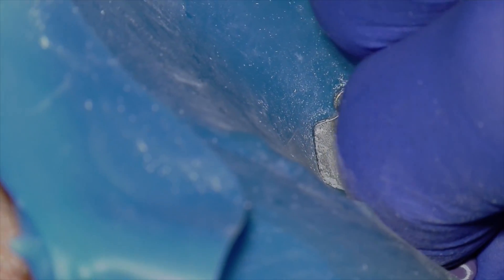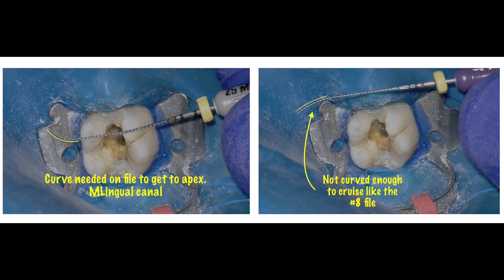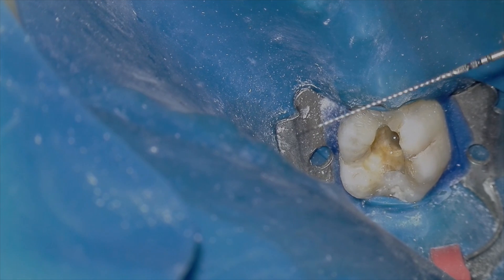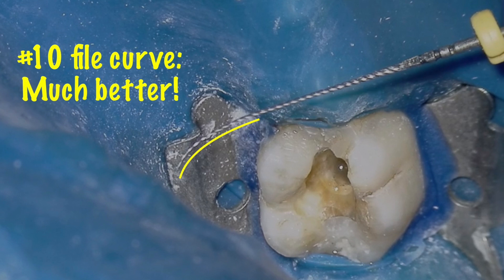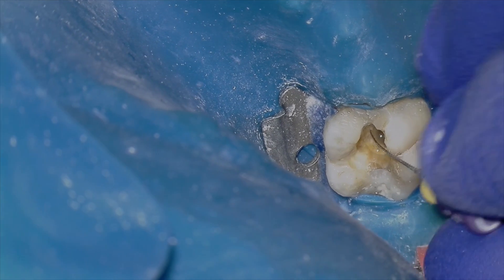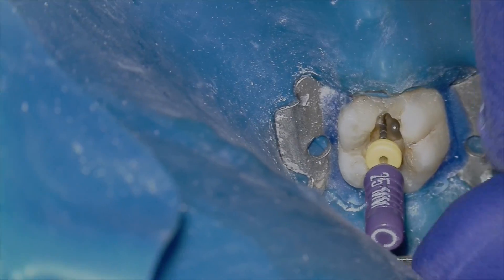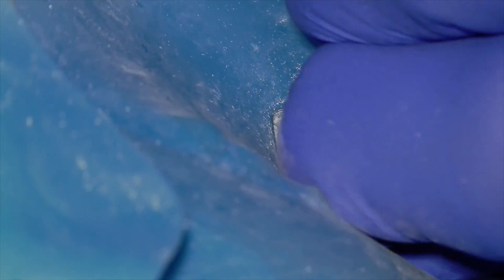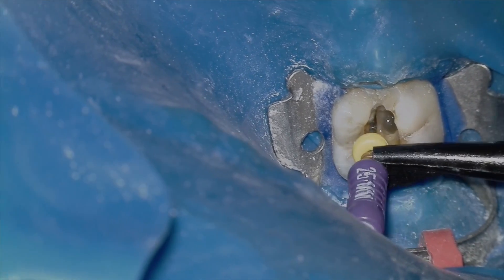I'm using cotton forceps to keep my fingers out of the way so you can see what's going on, then I get my hands in there to try to make it work, but it just will not go apically. So I've got to recurve it — I give it a nicer, better curve, and once I slide that file in and turn the uni-directional stopper towards the distobuccal, boom — straight down, just a nice little push. That's like the best feeling in the world. I take my apex locator, get the length, and that's it.